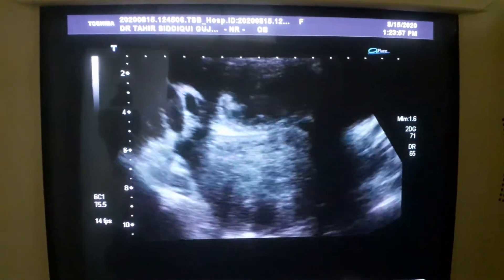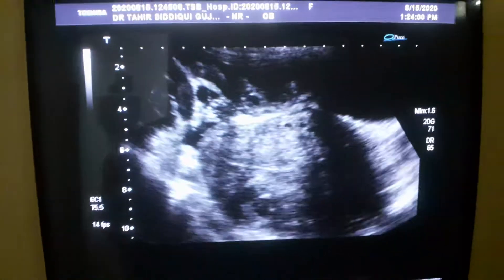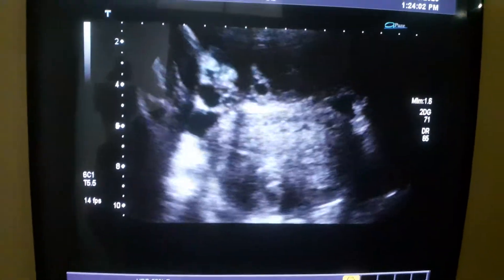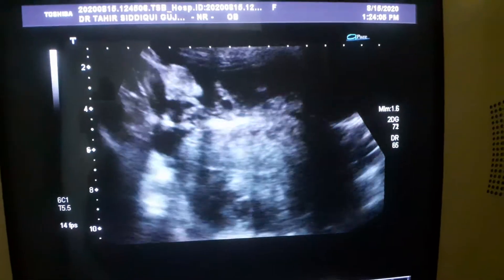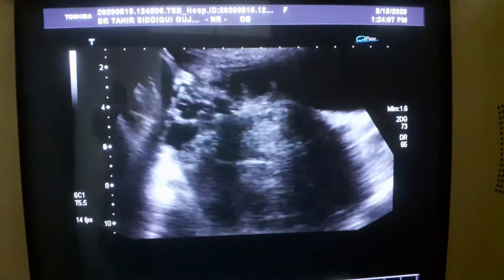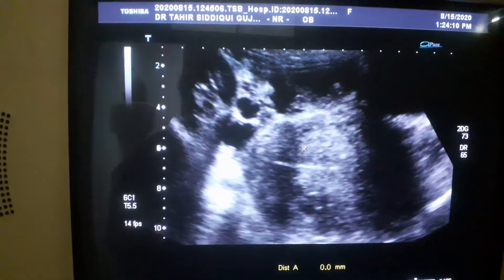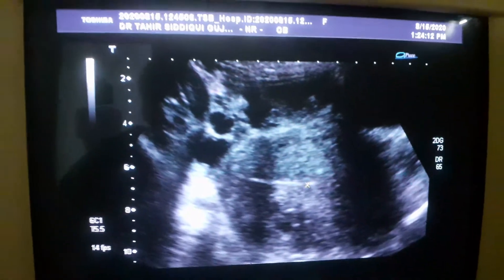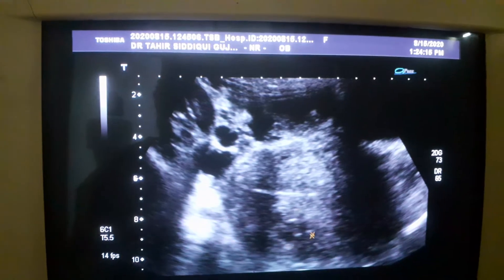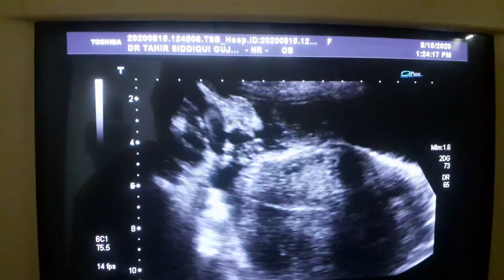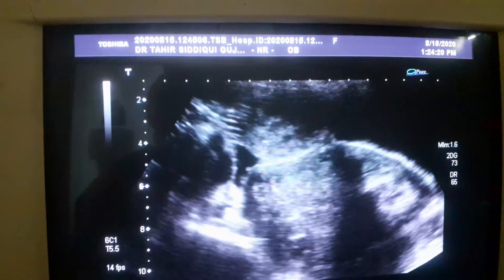Despite a lot of effort, I was unable to see the ovaries in transverse section by transabdominal approach. Now this is the endometrial canal in transverse section. This area is the fibroid. The outer surface of the uterus is intact.